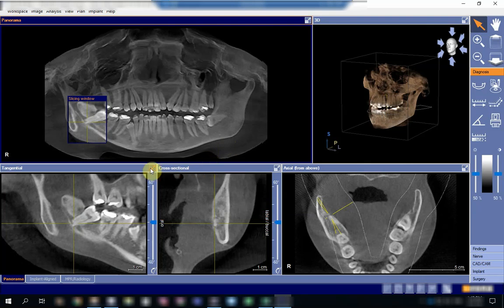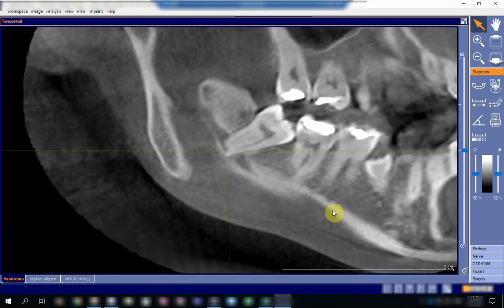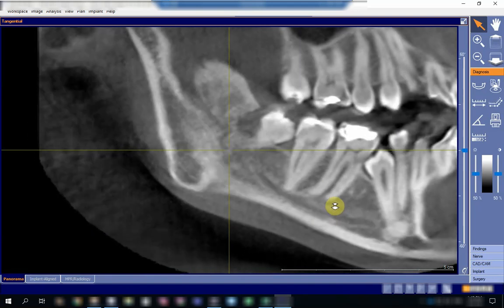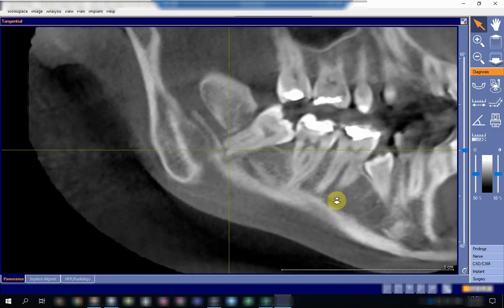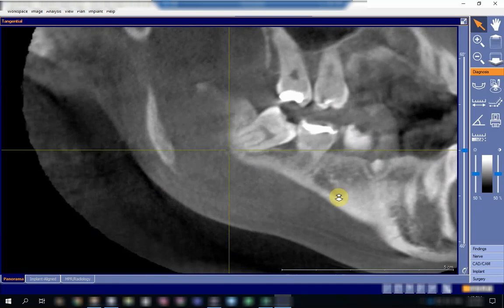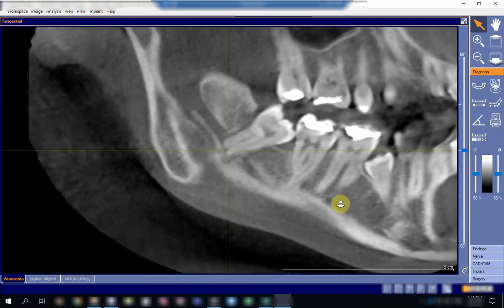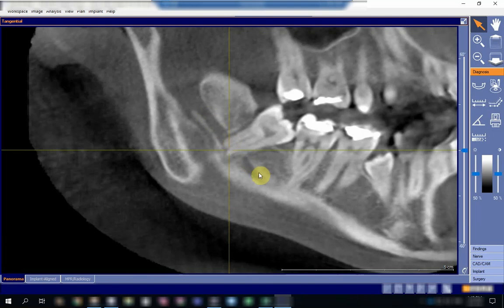First we will go to the sagittal plane and try to move medially and laterally to locate the inferior dental canal. This is the inferior dental canal over here—see how clear the course of the canal is in this view.